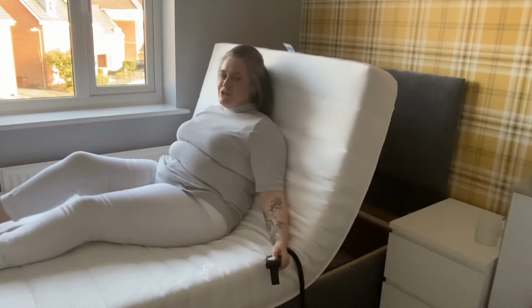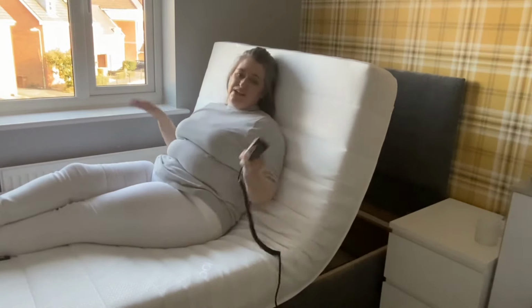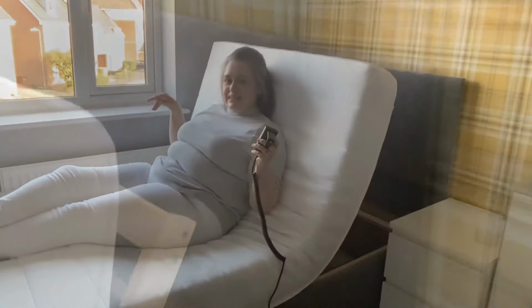It goes quite far up. Wow, yeah, so that is the bed fully up and you're sitting quite straight up, which is fantastic. Let's put this down and then we'll put the bottom half up for the legs. So before I put the bed down, just to quickly show you what it looks like back there. So obviously there's the headboard, the bed's up, so it's like a pit of nothingness. There's the back of the mattress and what it looks like.